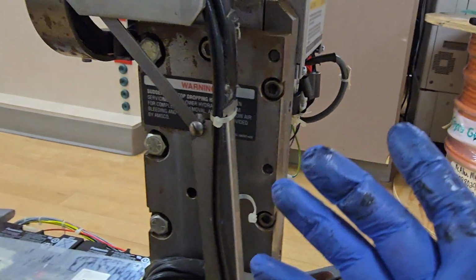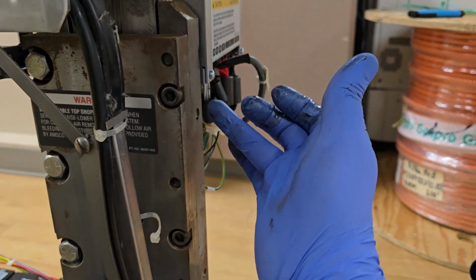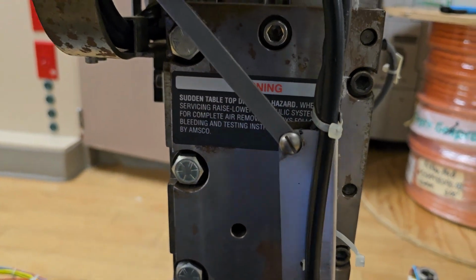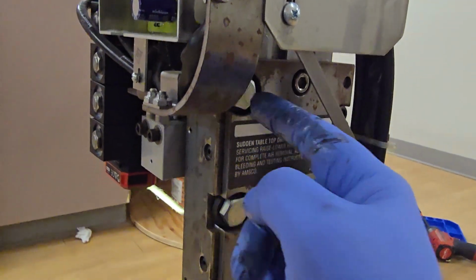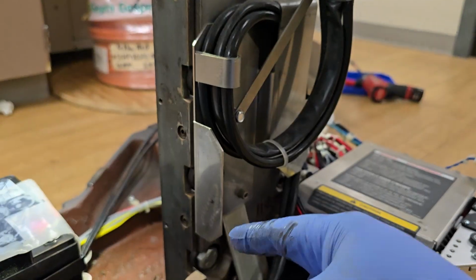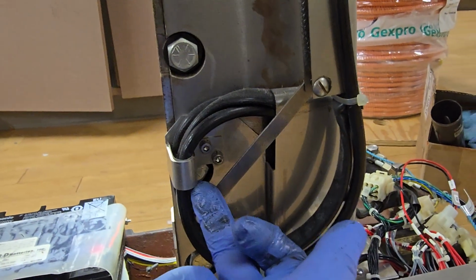So there's a couple of fasteners that you should pay attention to. These ones right here, there's a bolt through here, here, here, here, and here. This is your stationary side. This side over here is your floater. So on this side right here, you have these ones right here. They have to be loosened up. There, all the way down, right? You gotta pull this guy right here off to access that one.